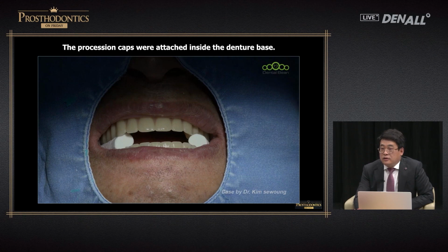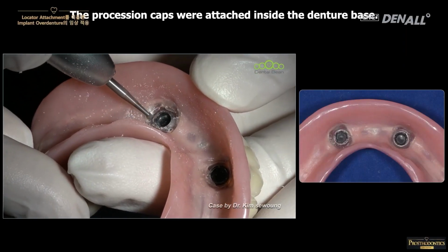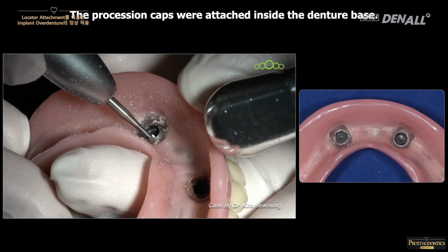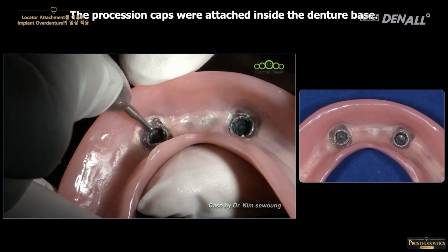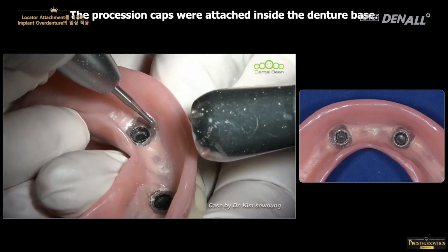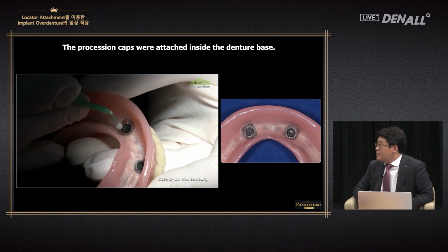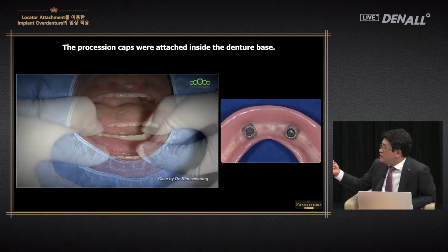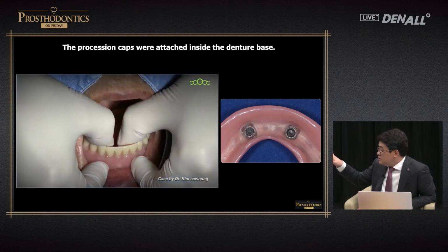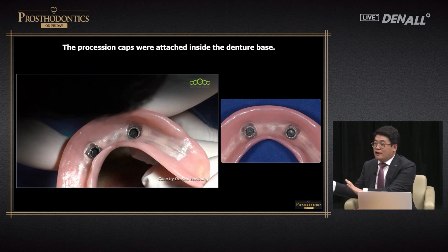When you remove the resin, once it hardens, at times the white silicone ring comes out together or it remains within the oral cavity. You remove that as shown in the video clip using a round burr. I've shown you illustration about it, and then you trim the surrounding. Once you wipe it using the gauze, because Vaseline has been applied here, you can remove resin very easily. At times, there can be air bubbles and additional adjustment may be required extraorally. After you do that, you need to position it within the oral cavity once again and let it harden, because if you let it set extraorally, it may cause problems with insertion. Air bubble is addressed like this.